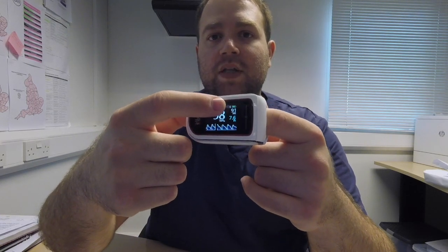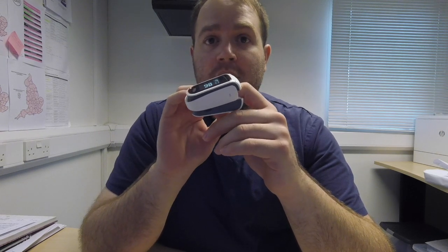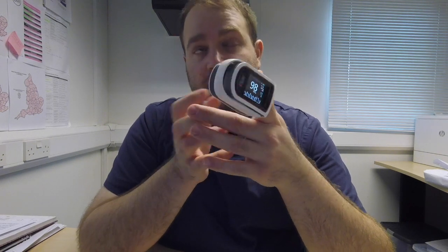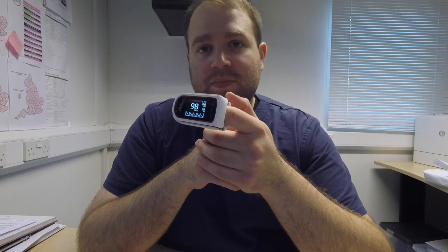On top there is the battery and Bluetooth indicator. Yes, this device has Bluetooth, but be aware there are two different versions: the MightySat and the MightySat RX. The first is meant to be used by everybody; the second is for health professionals only. There are also three subversions: one without Bluetooth and without pleth variability index or respiration rate; one with Bluetooth but without pleth variability index; and a third subversion with all options — pleth variability index, respiration rate, and Bluetooth.